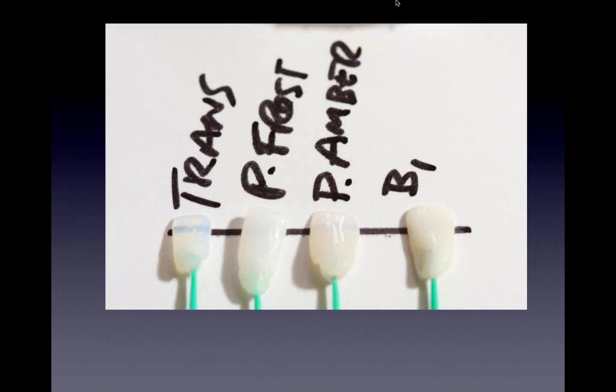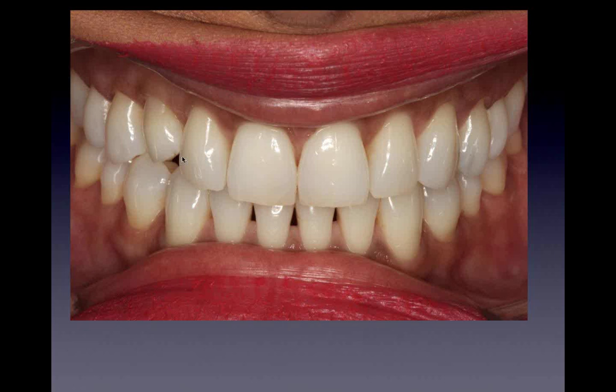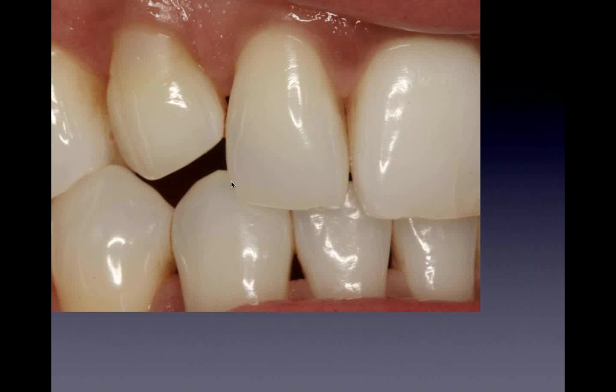So here's my tabs for this patient treatment. She has a canine. It's a deciduous canine, right? So if we have a deciduous canine, we really can't put any occlusion on it. So I'm going to be very conscious of my occlusion when I restore this tooth. But let's take a look at this patient. You see she's here in her occlusion.